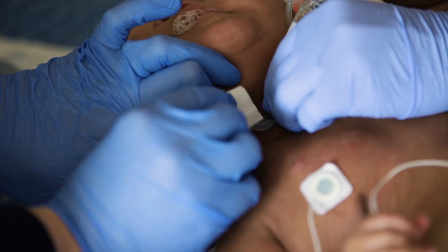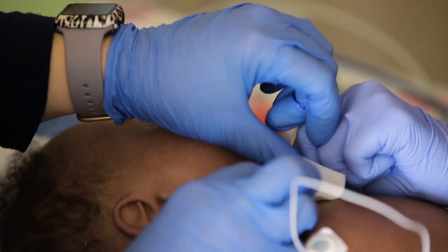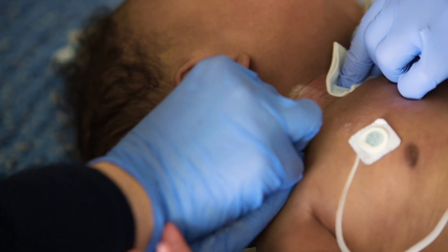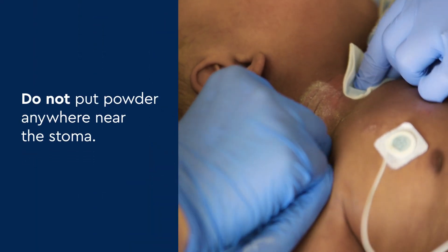After cleaning, pat the skin dry around the neck and trach stoma. Gently slide a new dressing under the trach wings around the trach stoma. If your doctor has prescribed a powder, put it directly on your child's skin around the neck, but do not put powder anywhere near the stoma.